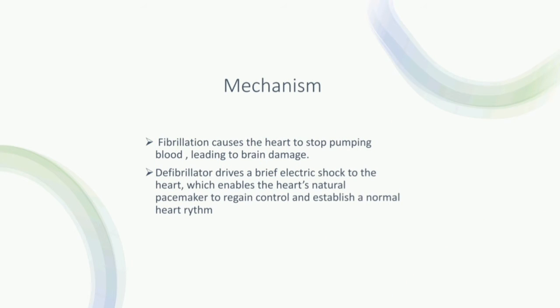Mechanism. In terms of mechanism, fibrillation causes the heart to stop pumping blood, thus leading to brain damage. A defibrillator delivers a brief electric shock to the heart, which enables the heart's natural pacemaker to regain control and establish a normal heart rhythm.